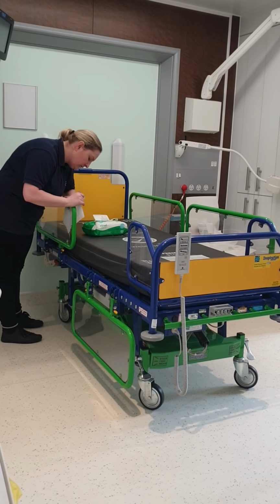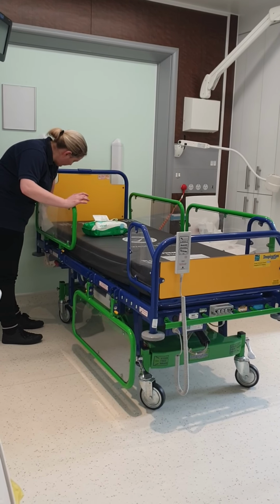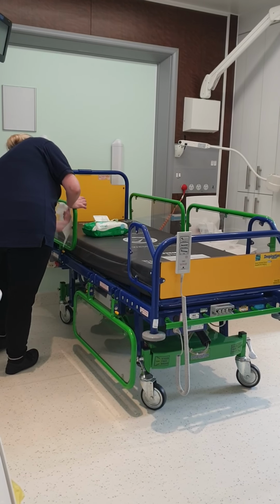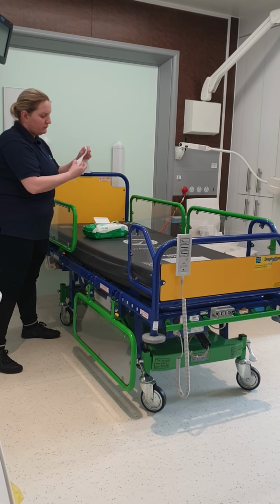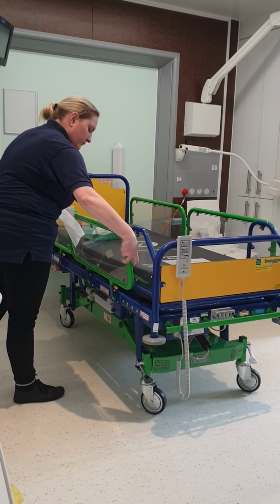The reason we're doing the bed rails last is because we always maintain the principle of cleaning from clean to dirty. So the mattress will have been covered whilst the patient stayed upon it. The bed rails we know are going to be high touch surfaces and therefore are being cleaned after the mattress.